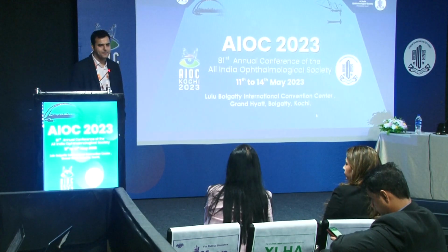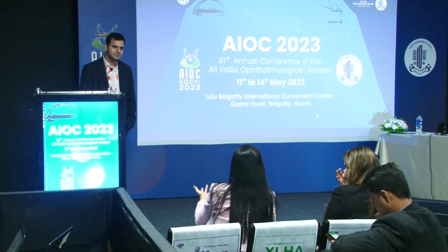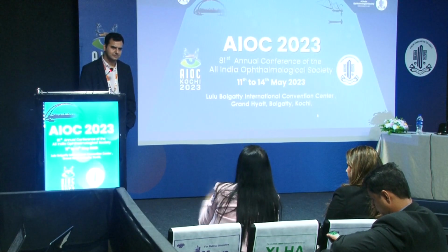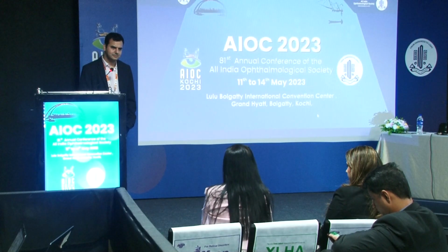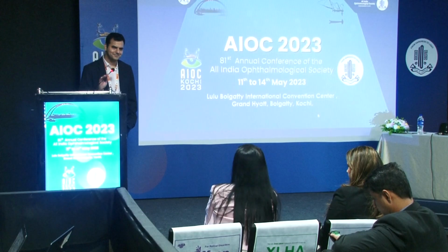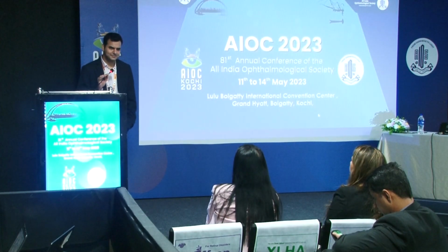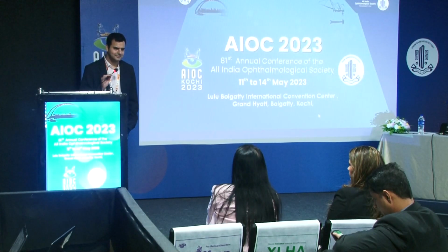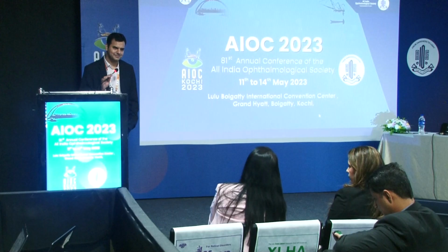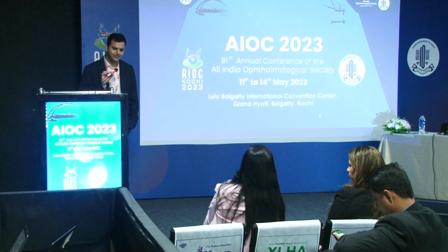You also need to see whether the IOL power calculation is an issue, but matching an ICL in one eye and a trifocal lens in the other eye, I have not gone ahead and done that. I have done one, and I went ahead with a monofocal lens, honestly, considering the age of the patient. However, if the patient is very motivated, I would go ahead with the trifocal lens, yes.